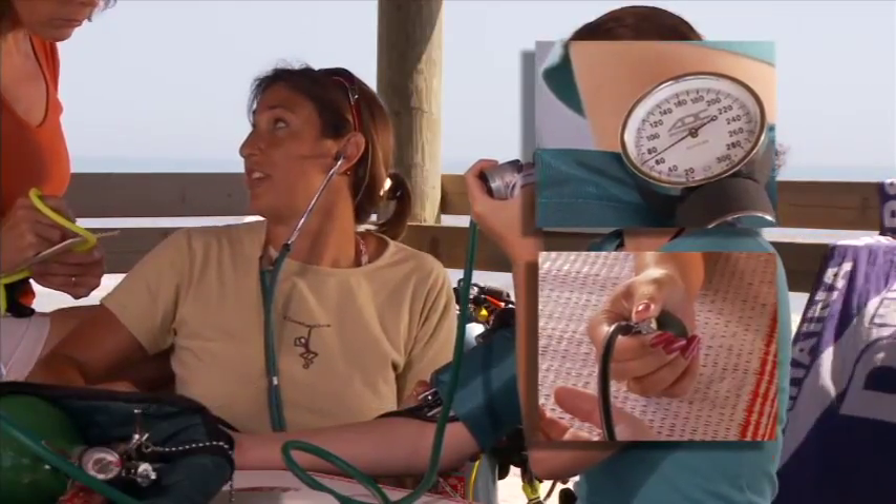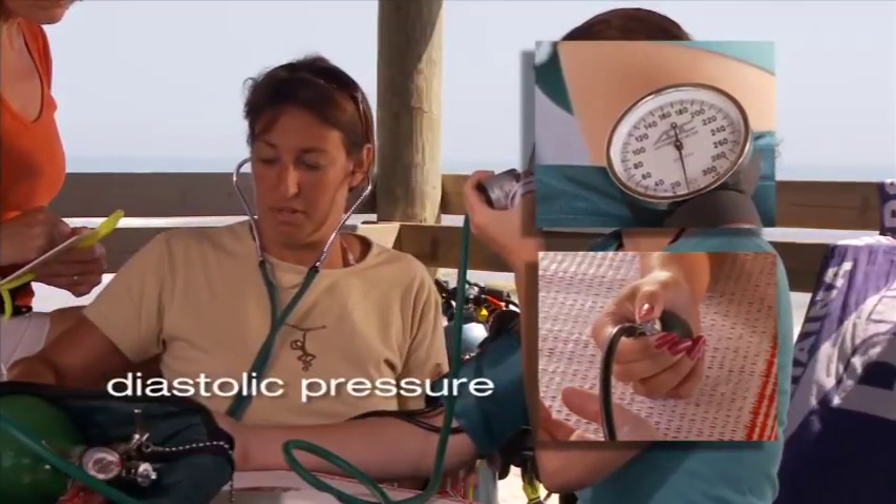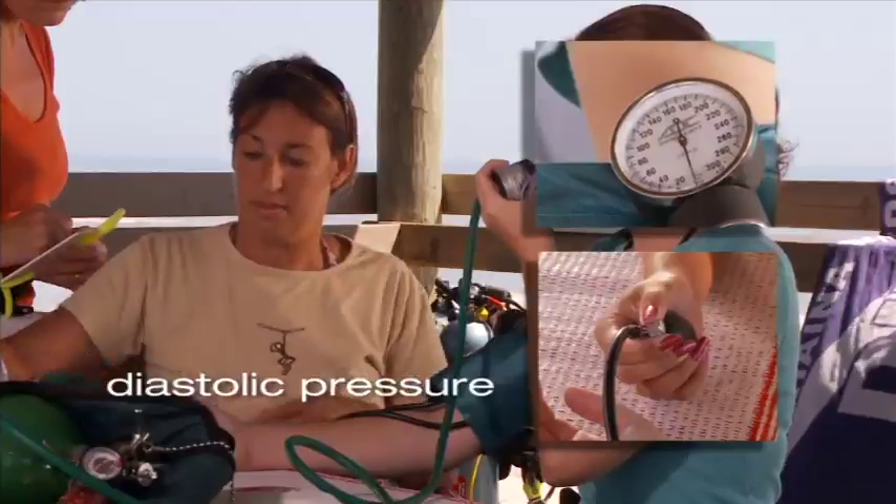Continue deflating the cuff. When you can no longer hear the heartbeat through the stethoscope, record that pressure. It is the diastolic pressure.